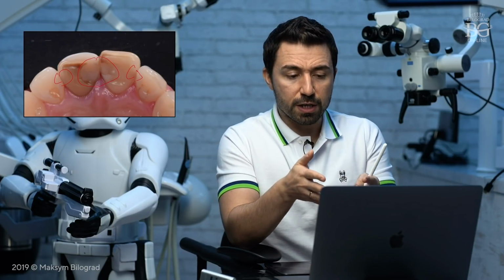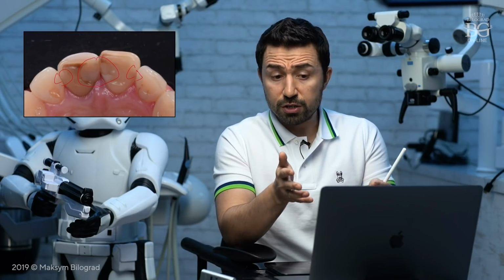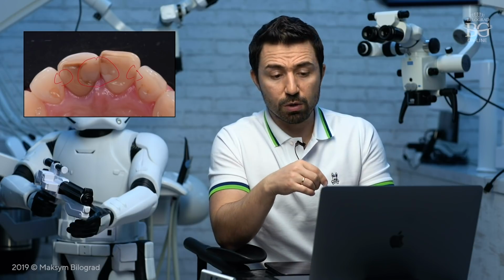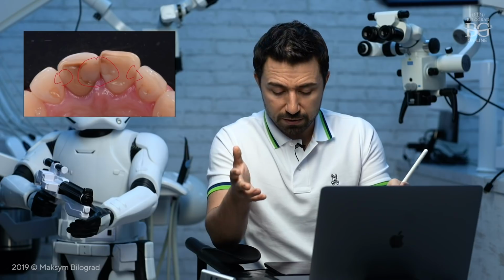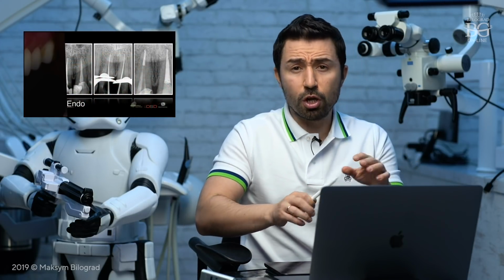It's not because of the endodontic treatment, it is because of the tooth structure lost, both from vestibular and from palatal area as well. So in that case, maybe the crowns will be much better. Anyways, endodontic treatment was not that difficult.